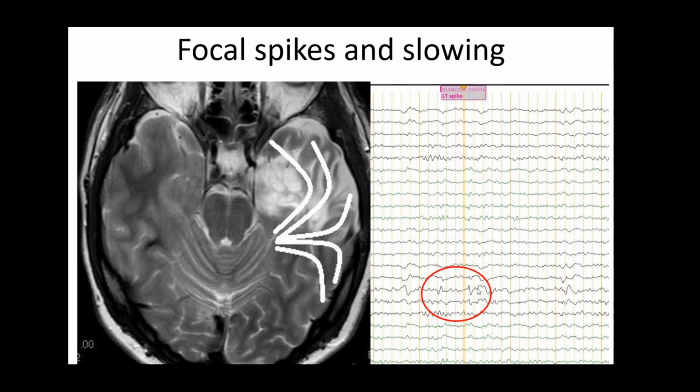And repolarization is a slow process, an active process. You use the sodium-potassium pump, whereas depolarization is simply the opening of a channel. So what's depolarization? You see a sharp wave or a spike, and repolarization, you see a delta wave. So a spike and a slow wave is what typically happens when you have hypersynchronous activity in one area of the brain.